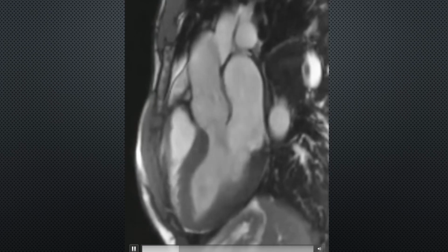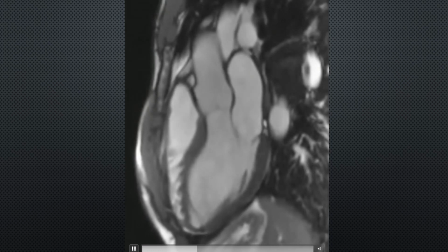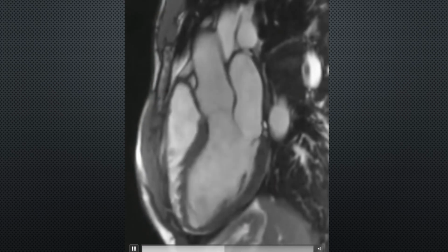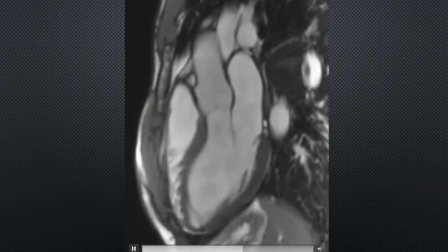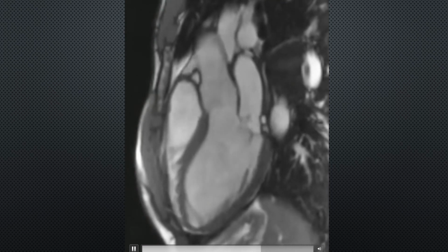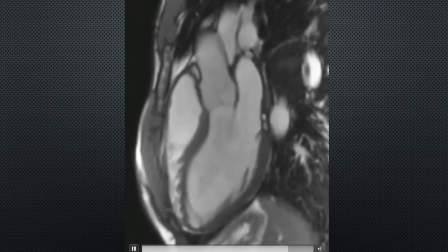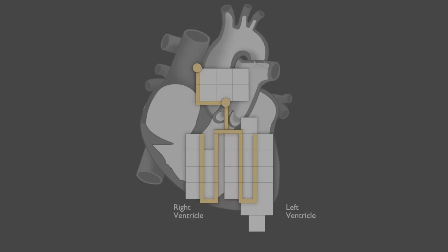Because of the special characteristics of cells in the heart that we talked about earlier, this whole sequence is reflected directly on the EKG. This heart right here is made up of about 3 billion cardiomyocytes. An EKG is the sum of all of the electrical signals of those 3 billion cells added together at once. The problem with our brains is that we're really good at counting to impossibly large numbers, but we're really bad at visualizing them. You can't visualize 3 billion of anything. So, as we start to move into EKGs, let's look at a heart that's only got a few dozen cells.